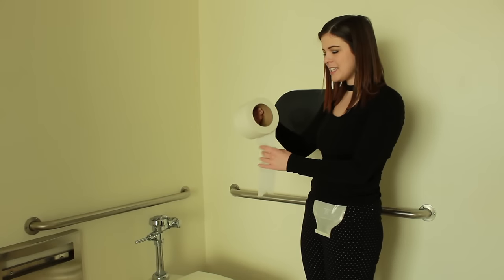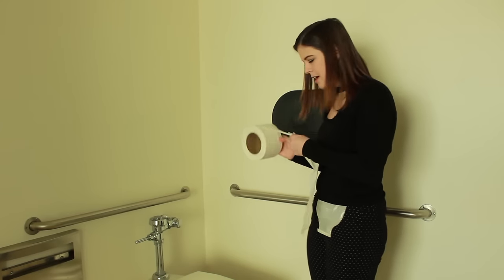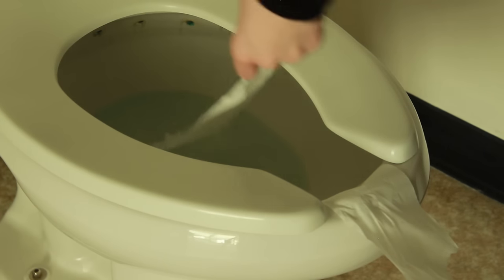The first thing that I do is take some toilet paper and place it in the bowl, and also over the side, so hopefully the toilet paper will prevent some splashing.